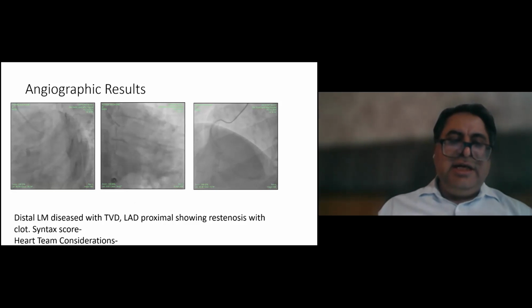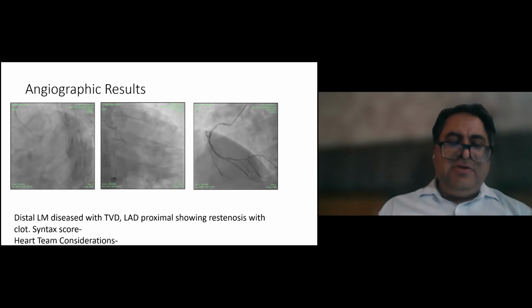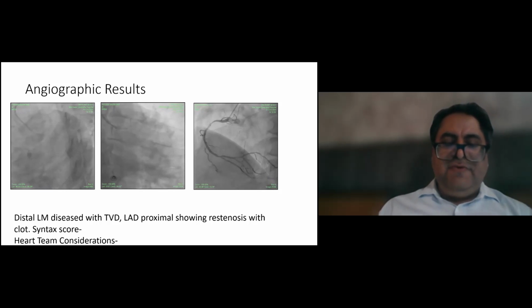Angiographically, I'm playing the slides. You can see the left main is diseased with triple vessel disease.